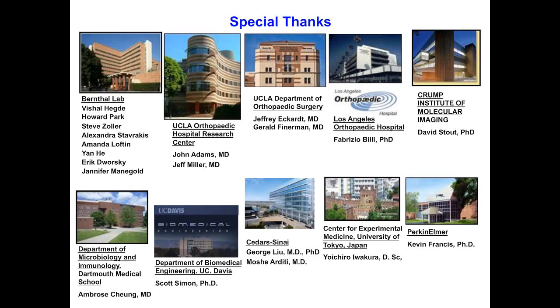Dr. Lee, with many imaging modalities, how does one select the imaging modality of choice? So that actually comes down to what is the basic research question that's trying to be addressed using these in vivo models. I mentioned that there's different types of imaging modalities, and each one offers different types of information. Functional imaging is if you're interested in looking at what happens to a cell, what is the biological activity of that cell during the imaging process.